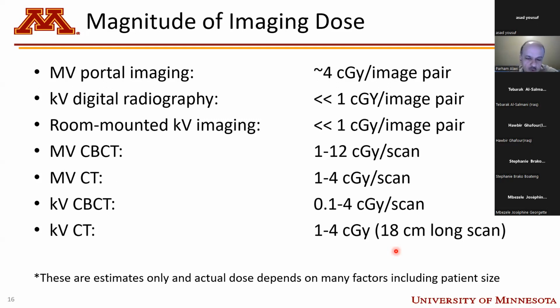I have a question here about where these doses are measured. This is the dose for the whole image area, like an average dose. There is a variation, as you can see, with depth, with patient, and all that. So this is just a general guideline.